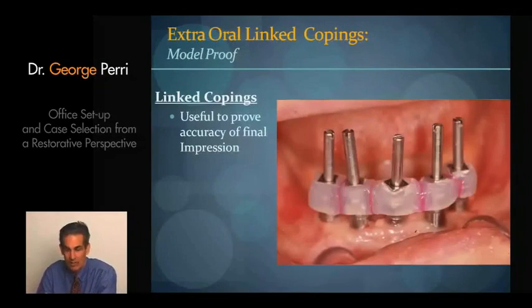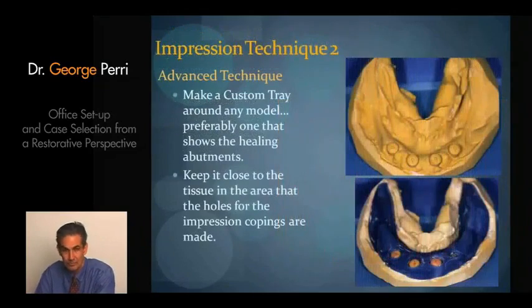I'll go ahead and separate this thing into its components, and I'll use the exact same technique and take a master model. But if it fits perfectly, in a very few minutes, I'll know that it's accurate, and I can go ahead and trust that master model. So I think this is a useful sidelight technique if you ever have doubts.